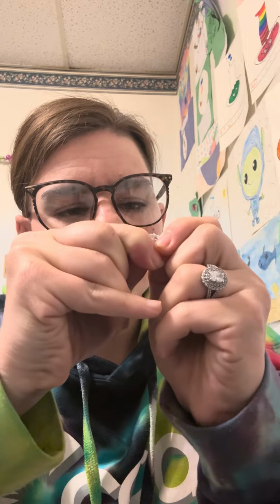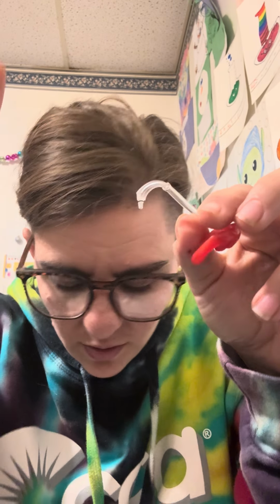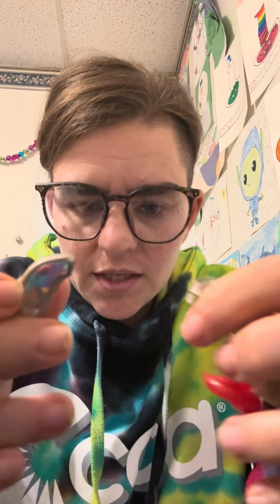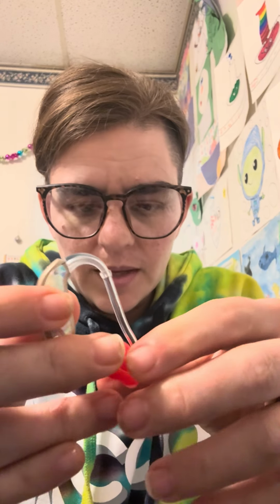Whoever already knows how to do this is probably watching me cringing right now. But there it is. Then you stick it back on like this. It just goes in here for this particular hearing aid. Some might be different, so listen to your audiologist.